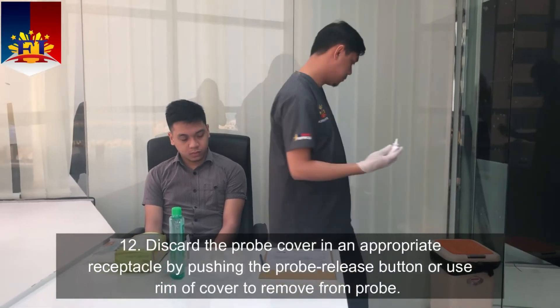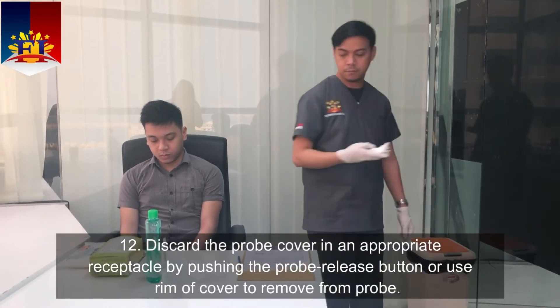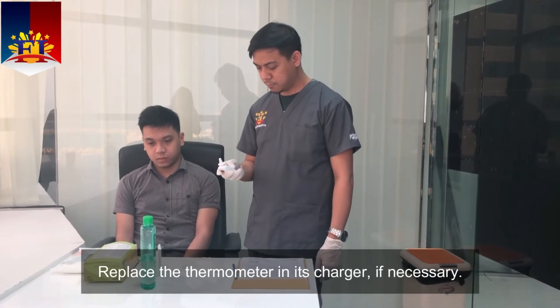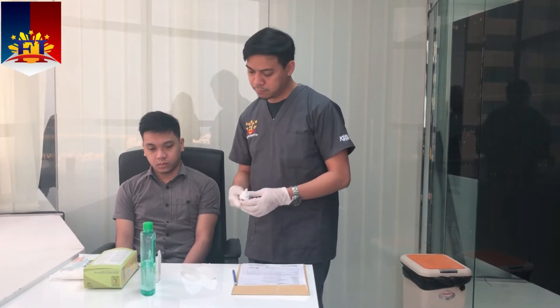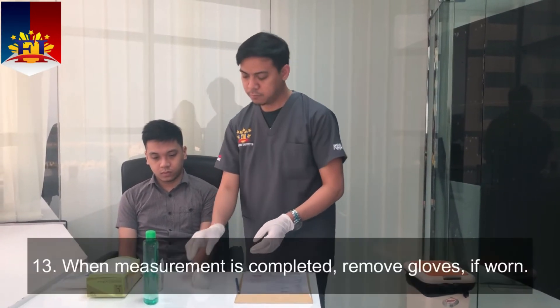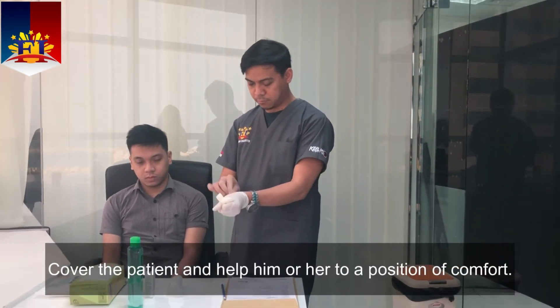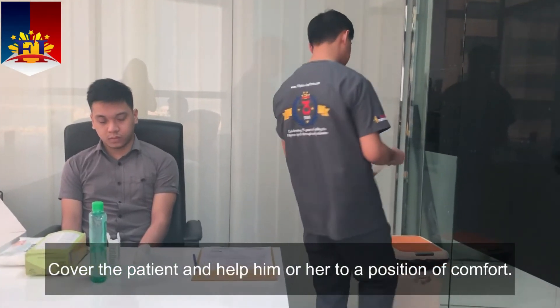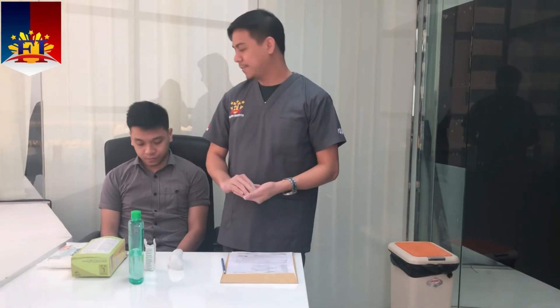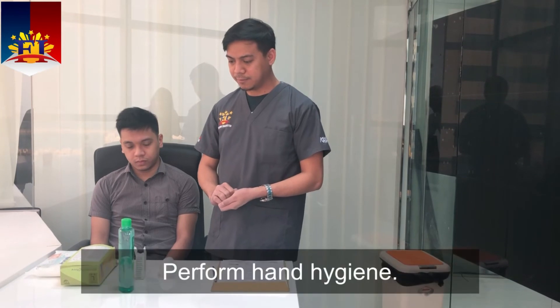Discard the probe cover in an appropriate receptacle by pushing the probe release button or use the rim of the cover to remove it from the probe. Replace the thermometer in its charger if necessary. When measurement is completed, remove gloves if worn. Cover the patient and help him or her to a position of comfort. Remove additional PPE if used. Perform hand hygiene.